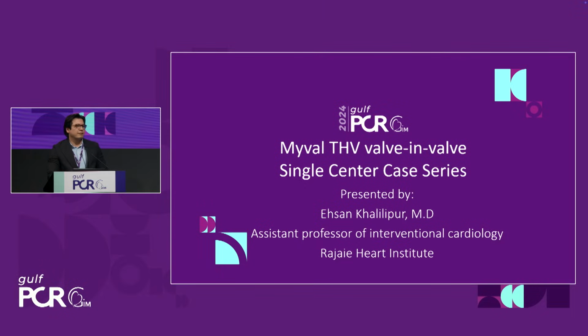Dear friends and colleagues, good afternoon. This is a great honor to be here. I am presenting our center data about the valve-in-valve procedure with Myval THV.